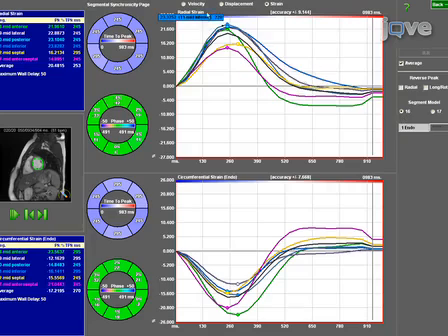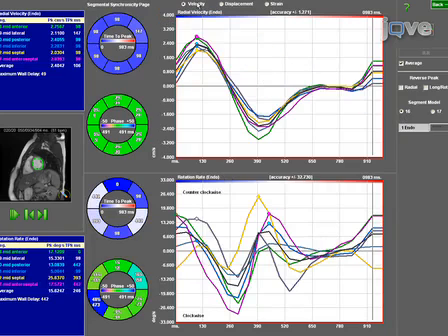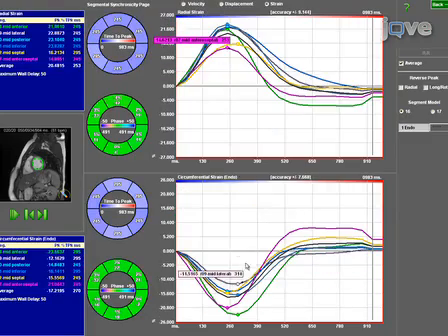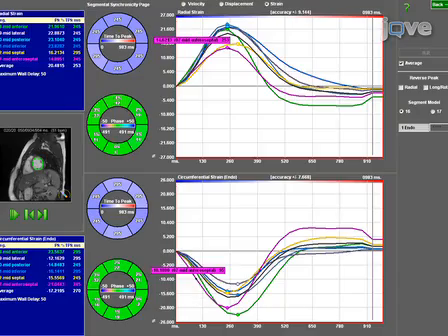Finally, the tracing is analyzed for circumferential strain assessment. Absolute as well as regional values of velocities, displacement, and strain can be derived.